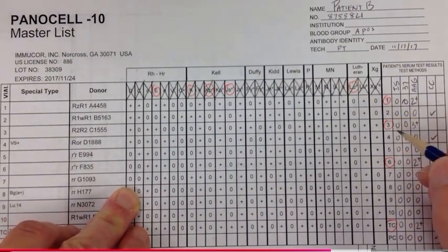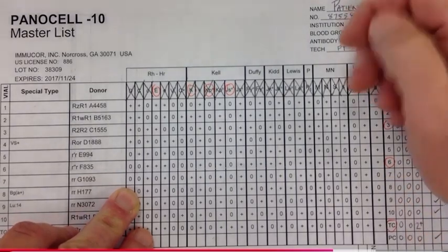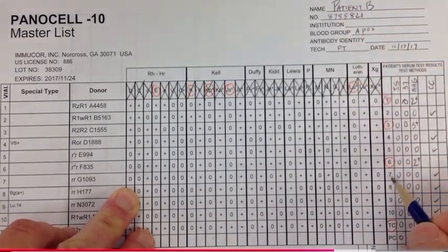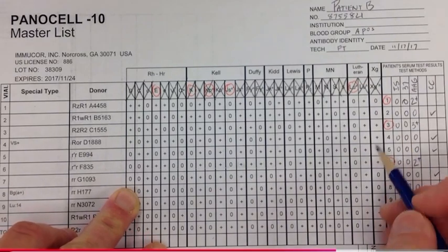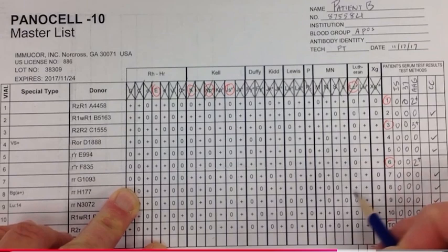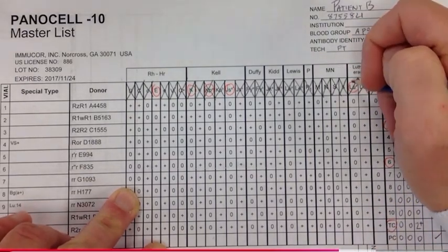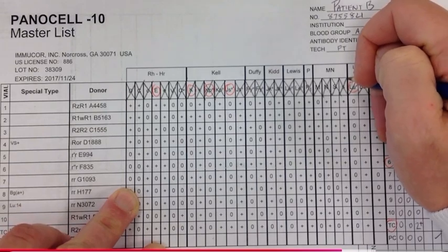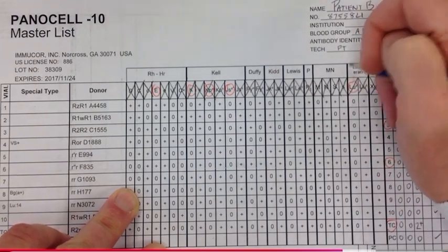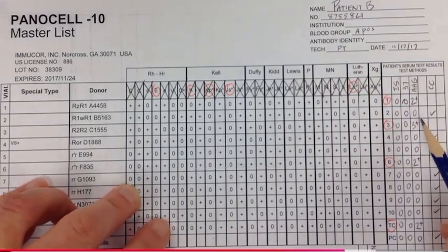But that being said, I'm going to go ahead and rule it out and consider it, because unlike JSA, which is positive here for a cell that is positive, this is not. It's negative here. So once again, if I go and do a crossmatch and there's a problem, this is one of the ones that I may have to go back and look at. But depending on the lab you're in, you may be required to go ahead and get another cell and rule that one out.